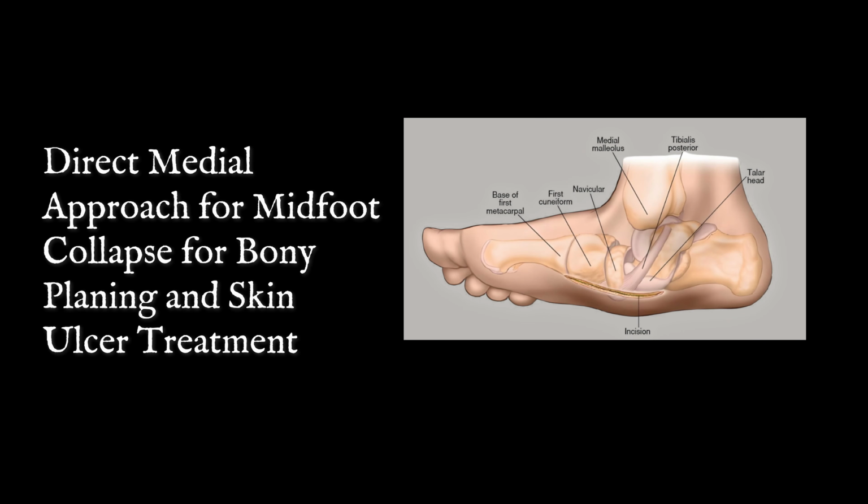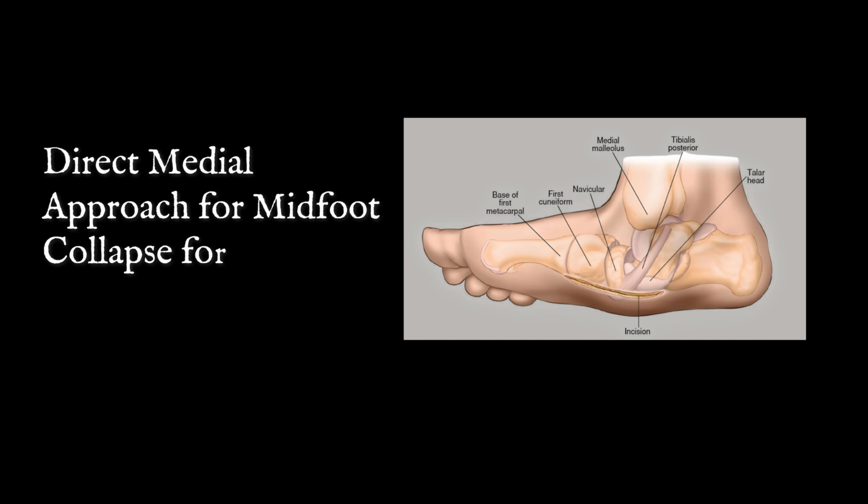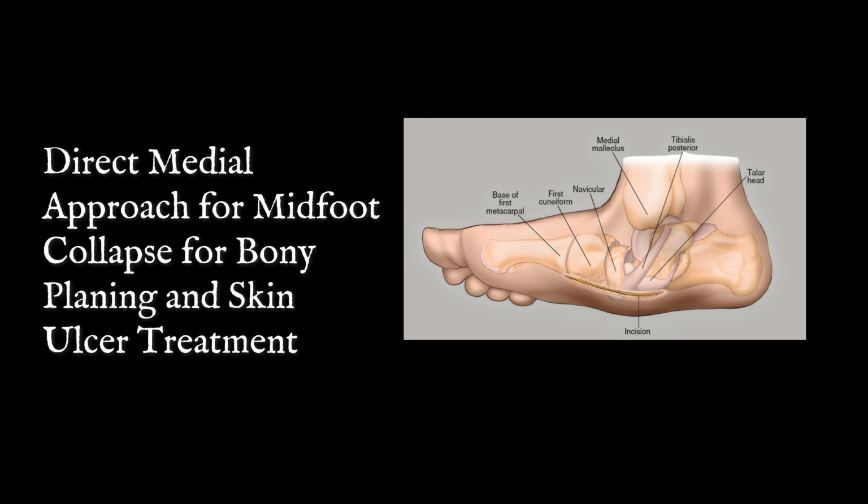Direct medial approach for midfoot collapse for bony planing and skin ulcer treatment.